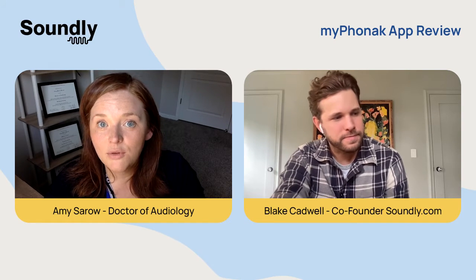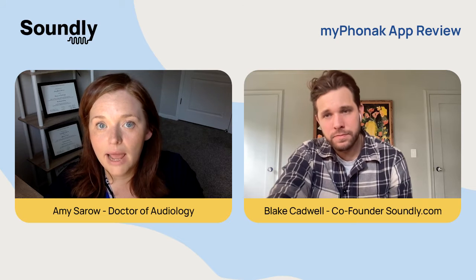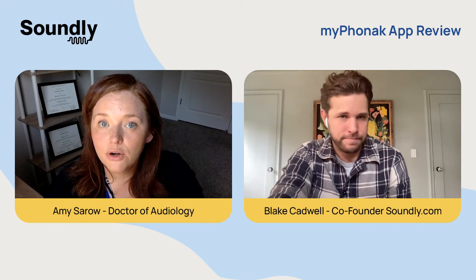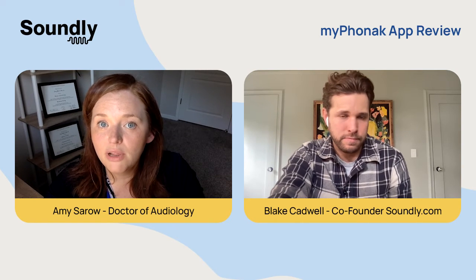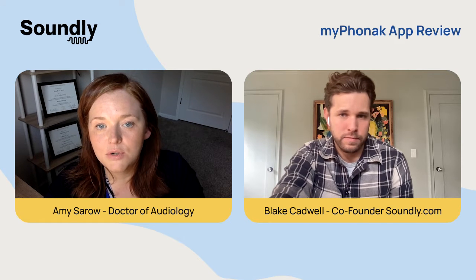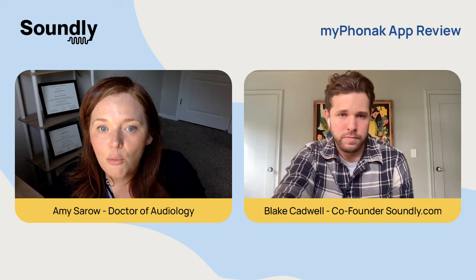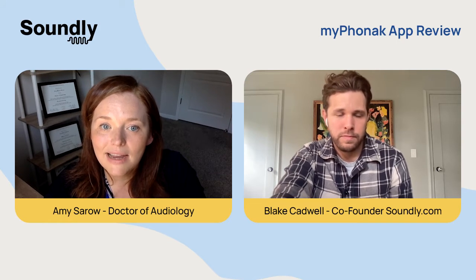Now I'm going to walk you through the steps so that you can connect your new hearing aids to the My Phonak app. First, go to the Google Play Store if you have an Android phone, or go to the App Store to download the My Phonak app. Once that is done, you'll open the app and select 'Skip Tour' when the next screen comes up.